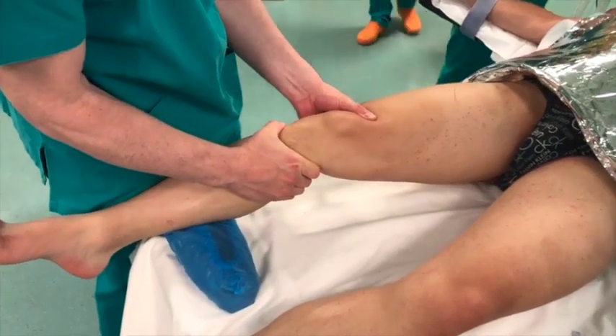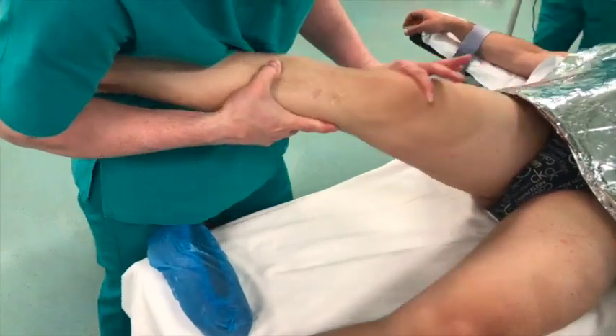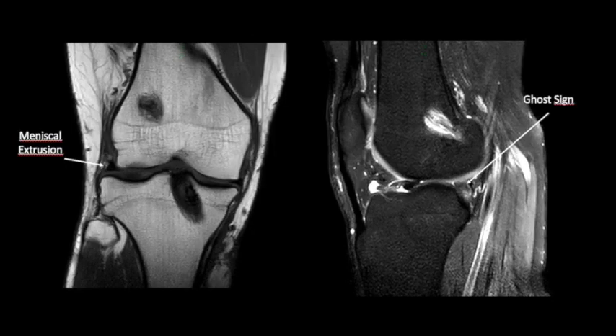Preoperative clinical examination shows a positive Lachman test, anterior drawer test, and a pivot shift test. Preoperative MRI shows lateral meniscal extrusion and the ghost sign, which is an indirect sign of a lateral posterior horn tear.